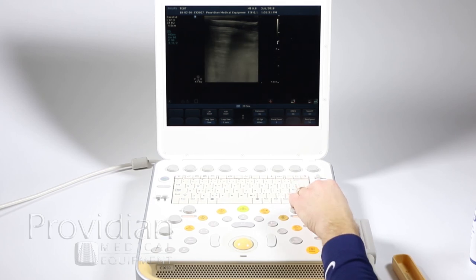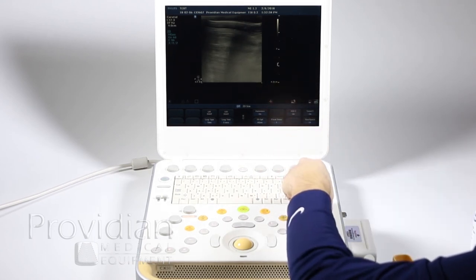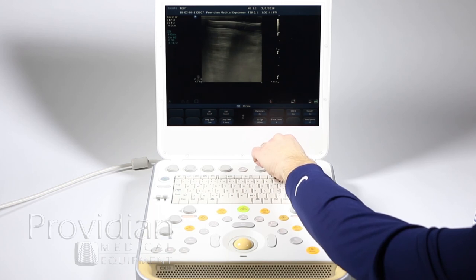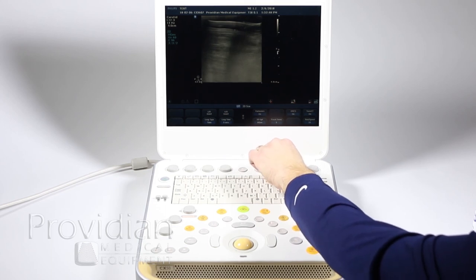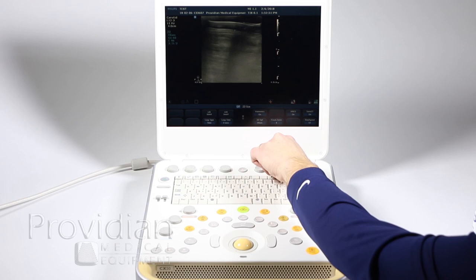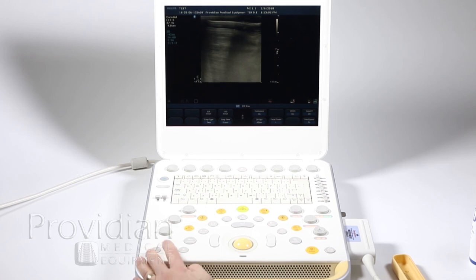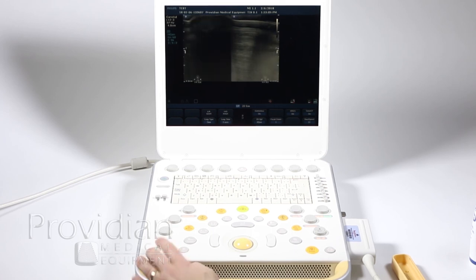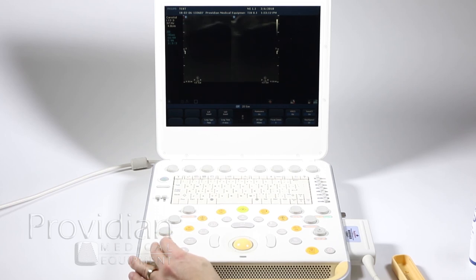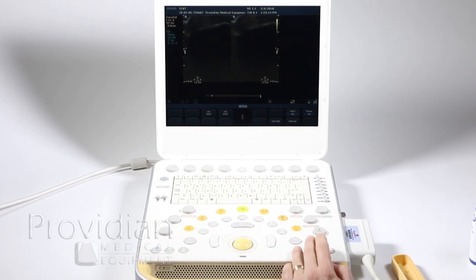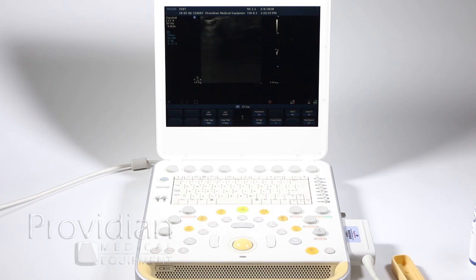We have our depth control, and you can also change your focal zone. These little arrows show where your focal zone is — you can add focal zones and adjust them. Note that the more focal zones you add, the lower the frame rate: when I went up to four focal zones, it went from 37 frames per second down to 11. We also have dual imaging — click dual and a little red dot shows which is the live image. You can go back and forth left and right, then freeze to freeze both images, and click dual again to go back to your main imaging screen.